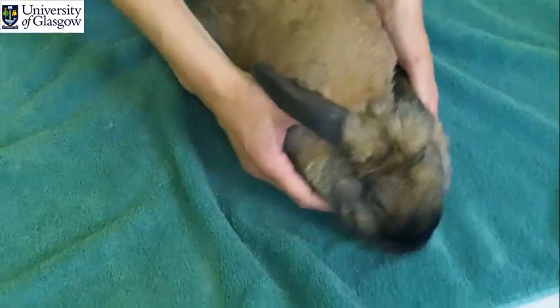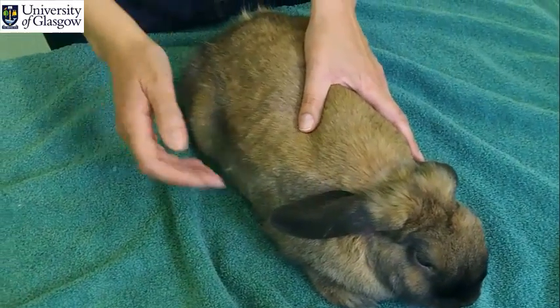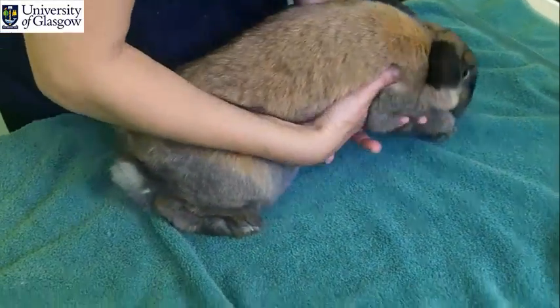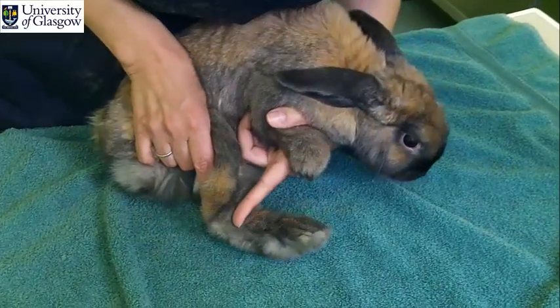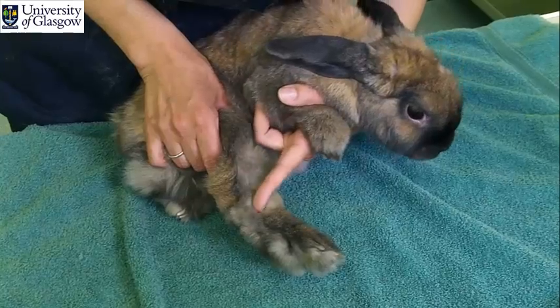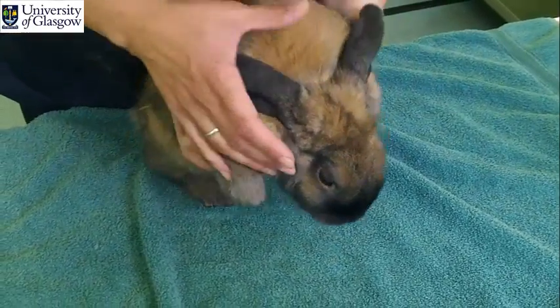Another place where to do intravenous injection or collect blood is from the lateral saphenous vein that we find again on the hind legs, and it runs in this position. This is the saphenous vein, it is a really good vein if we also want to collect blood.